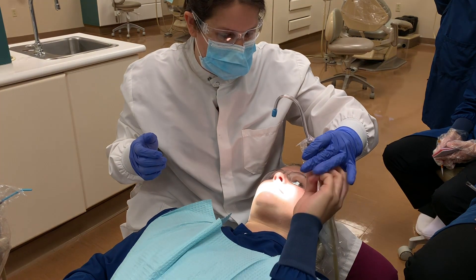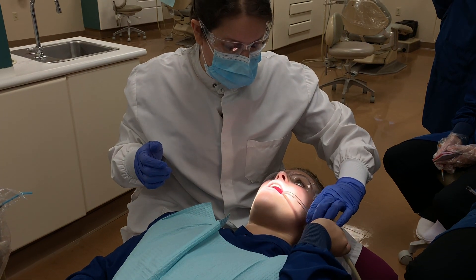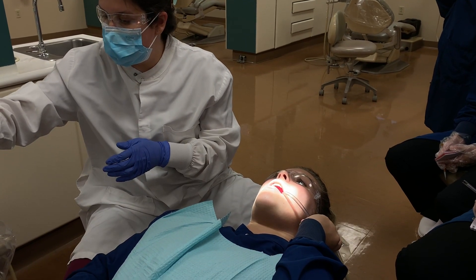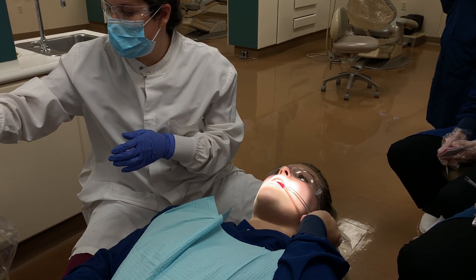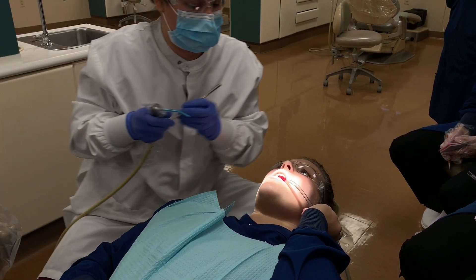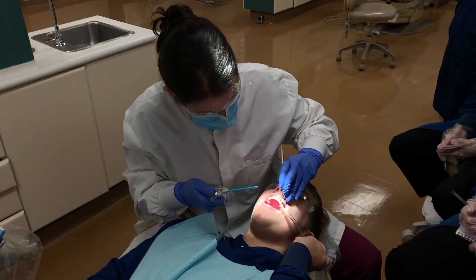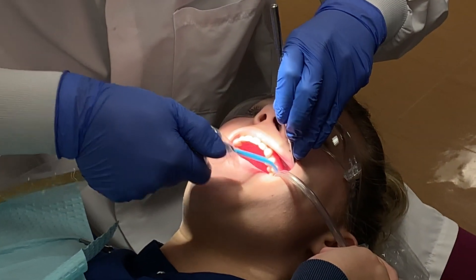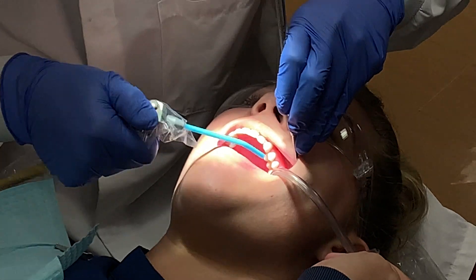You could ask the patient to hold the suction, and you want to dry the area that you're working on, working in large areas. Try not to swallow, and you're going to cover all surfaces of the teeth.